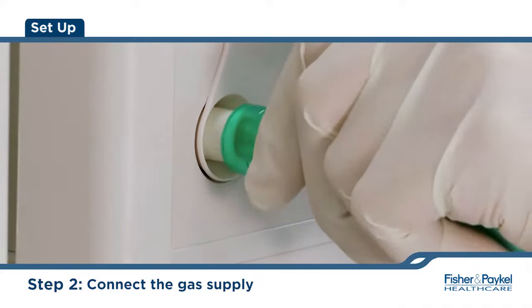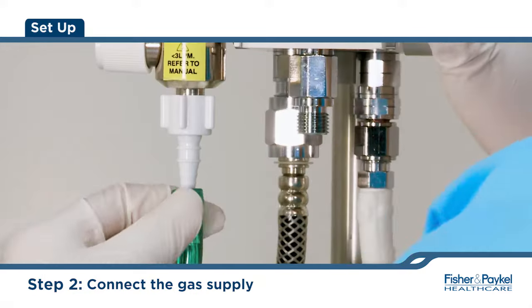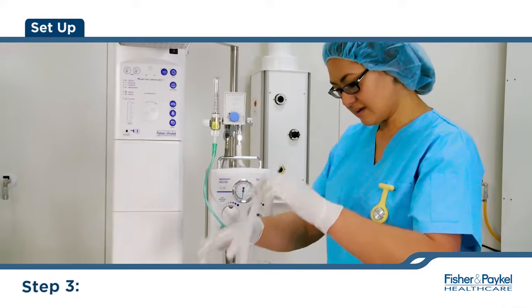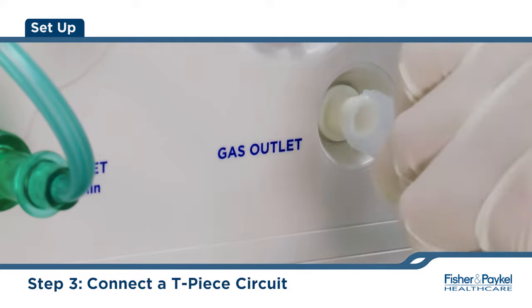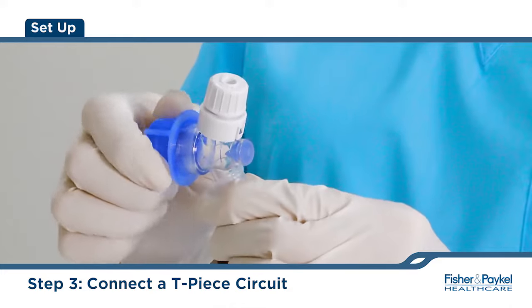Connect an oxygen or blended oxygen air supply to the gas inlet port using the gas supply line. Connect a TP circuit to the gas outlet port. Leave the blue cap on the TP circuit or connect a test lung.